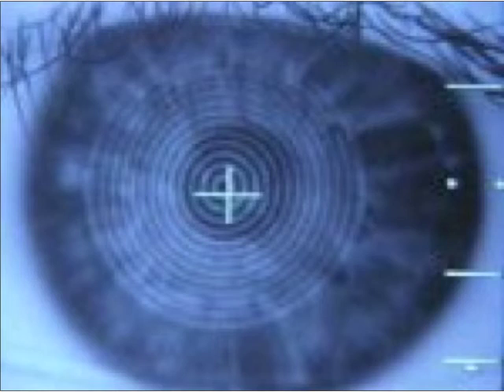So this is what a photokeratoscope image might look like. And again, I ask you, does this patient have a spherical cornea or not?